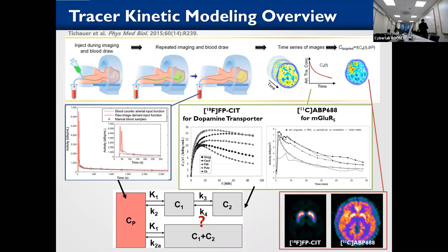So kinetic modeling is doing this kind of job. It means kinetic modeling makes the data less time dependent. We have all the dynamics, and we can change the time scale somehow, mathematically. Even if the individual bolus injection speed is different, it does not matter for this kind of study.